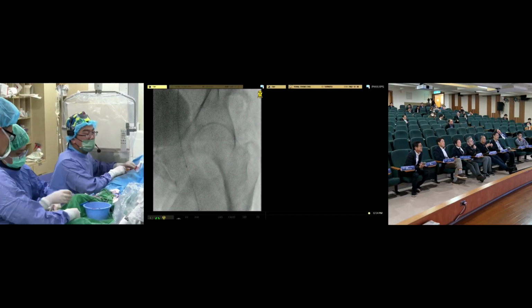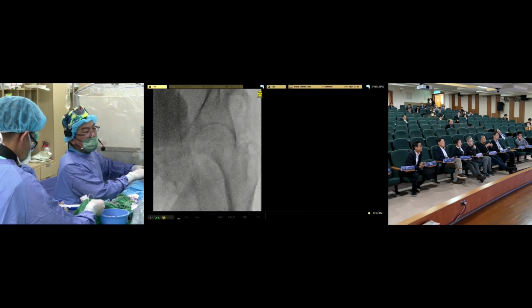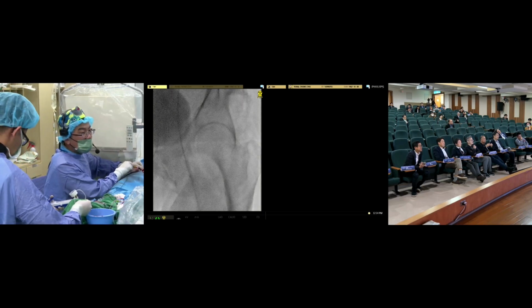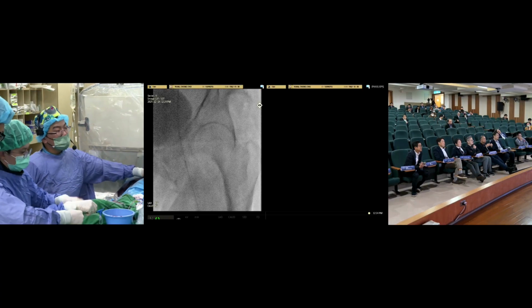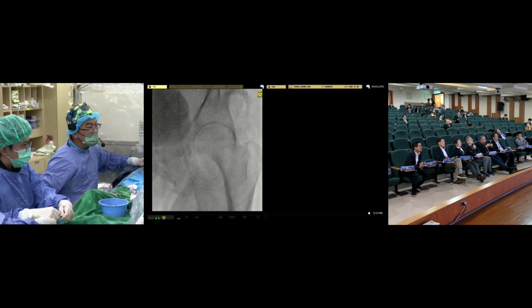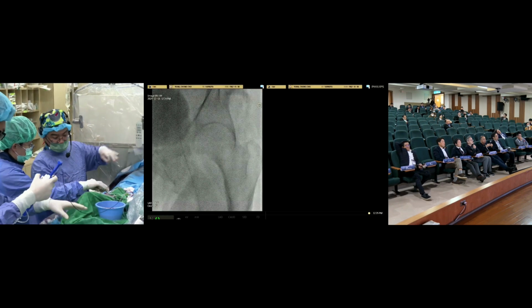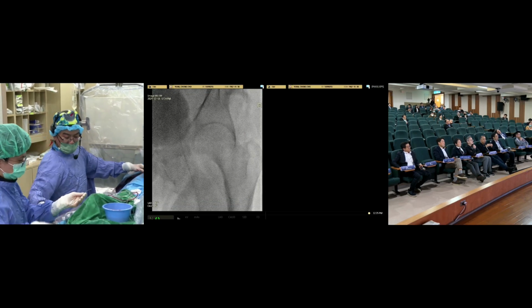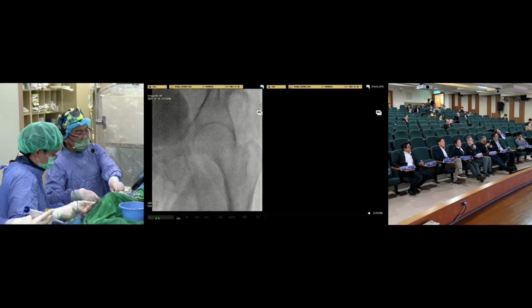Deep breath. Okay. Take a deep breath. Okay, let me try. Yes, we use the short stent first, and then deploy the stent later. Thank you. Roll it first.